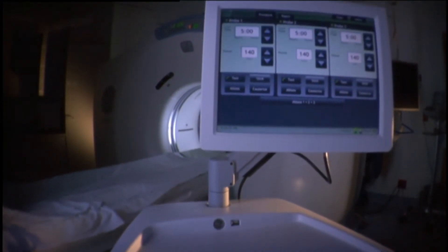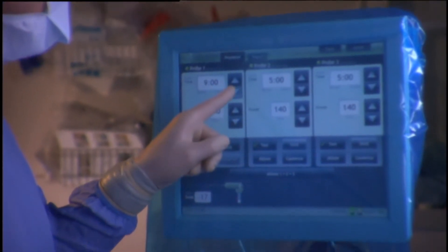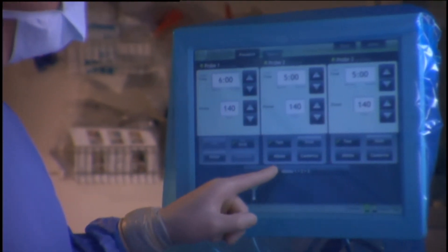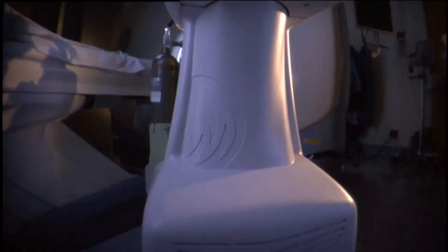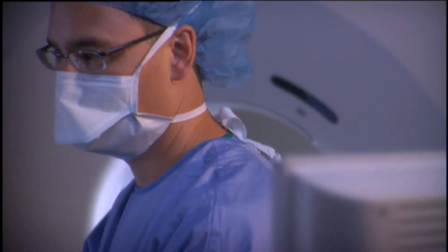SIRTIS 140 is the first solid-state three-channel microwave delivery system for solid tumor ablation. The SIRTIS 140 is really designed to be an enabling tool for physicians that will allow them to treat a wider range of patients. This machine will ooze leadership when somebody uses it. It will be obvious to users in this field that this device was engineered for the physicians and for the patients from the ground up.